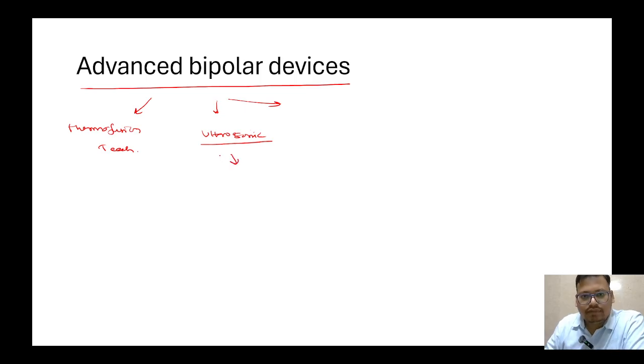In ultrasonic we use sound waves or frequency for coagulation. That is the harmonic scalpel. For the thermofusion technique, we have LigaSure. I will explain each one by one.